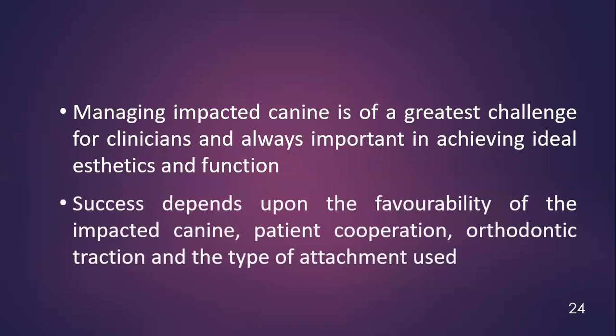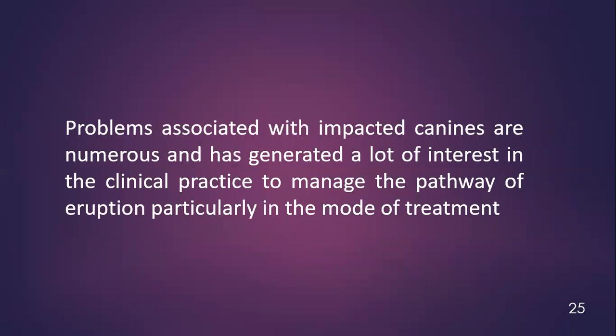The success of the impacted canine depends upon the favorable position of the canine. You also require patient cooperation, the orthodontic traction, and the type of attachment that you are using.